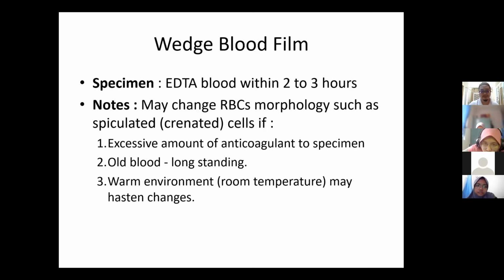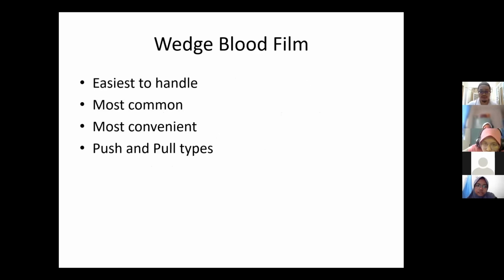Make sure that the laboratory, the transport or the storage area is at the right temperature, and look at the sample itself. Kalau belum 2 jam lagi tapi dah clot ataupun showing crenation, for example, you jangan take things for granted. Must still check the quality of the blood. Oh, dah dekat 10 minit, kurang 10 minit.